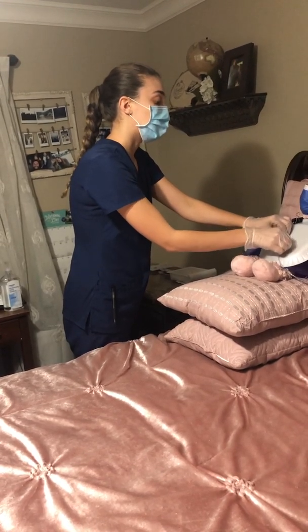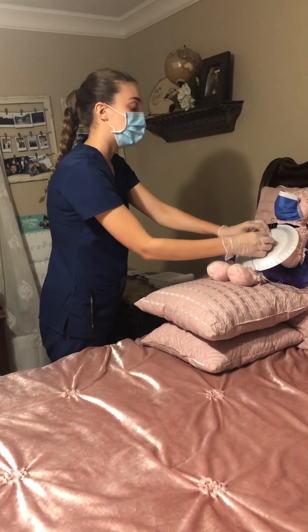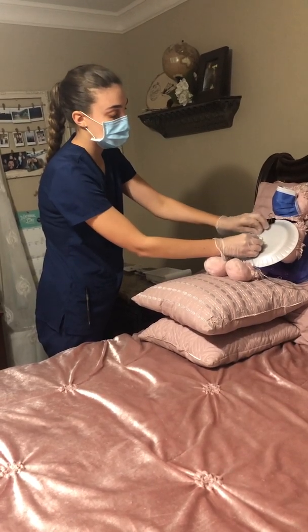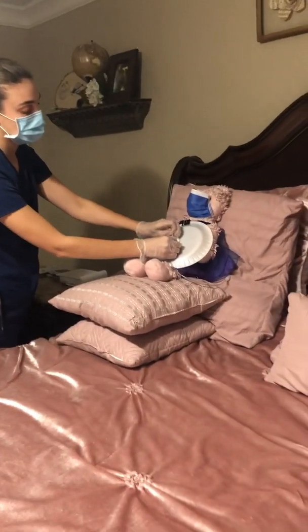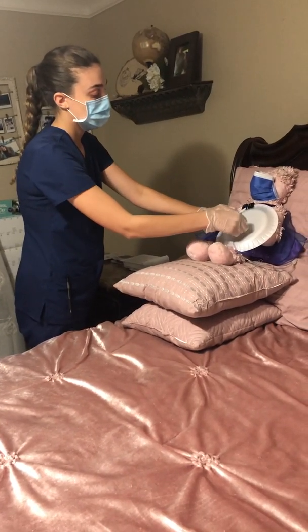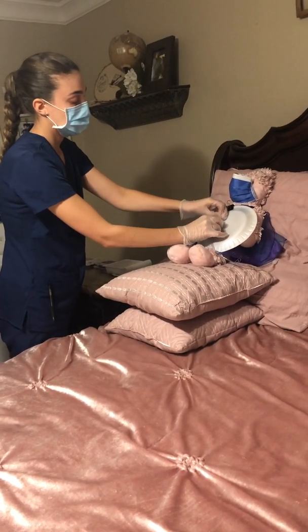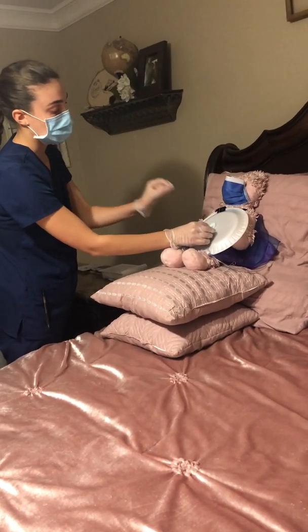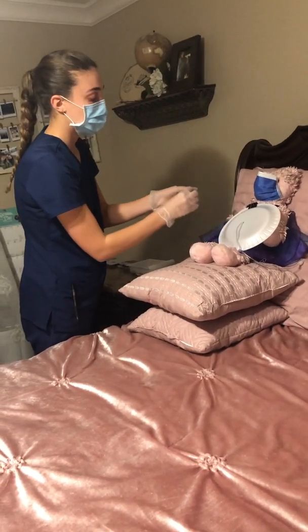You're doing okay, Mrs. Jones? I know it's kind of sticky. Just let me know if you have any pain. Stabilizing the tube. Okay, good job. And I'm going to go ahead and take the bio patch off. Okay, I'm going to dispose of these.